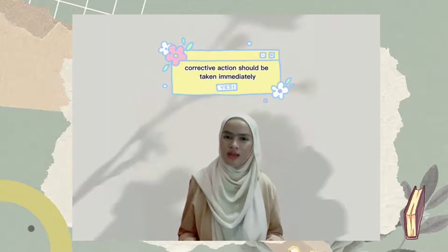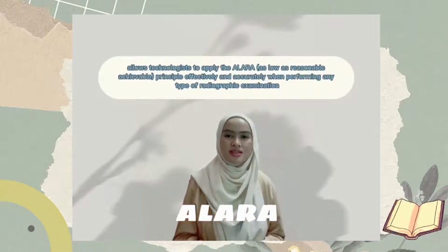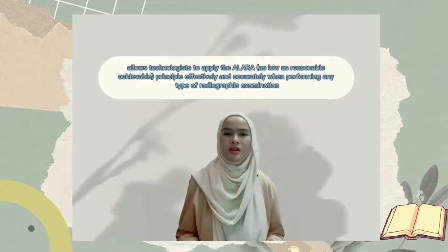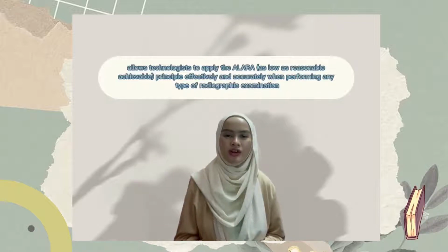Also, if the timer is suspected to be malfunctioning, corrective action should be taken immediately. The quality control test allows technologists to apply the ALARA principle, which is as low as reasonably achievable, effectively and accurately when performing any type of radiographic examination.